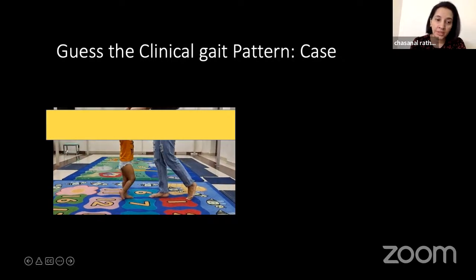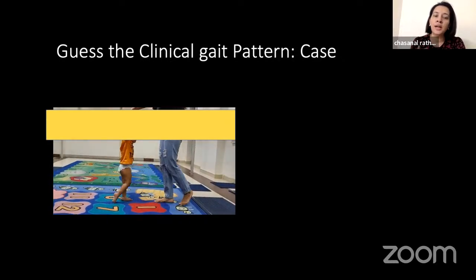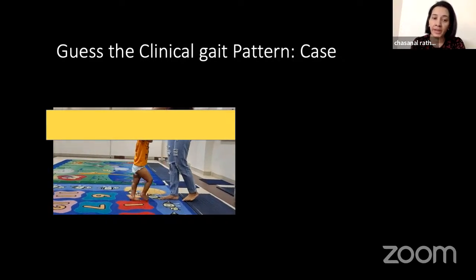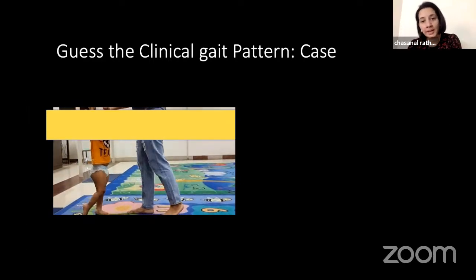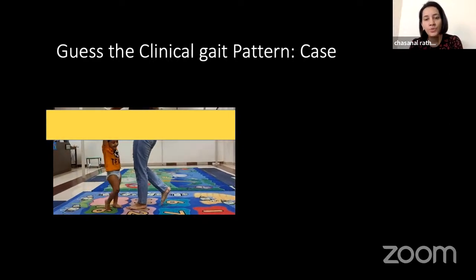He's a diplegic. If you see the right side, he still continues to walk as a jump pattern, but on the left side there has been a midfoot break, and now there is a neutral position. So I can't put him as a jump gait, nor can I label him in a crouch. So here the 3D gait analysis gives us much better options.